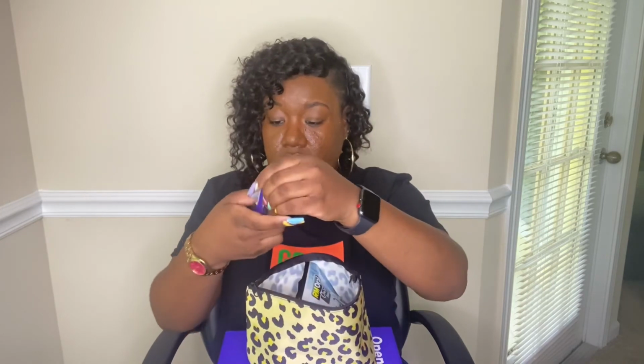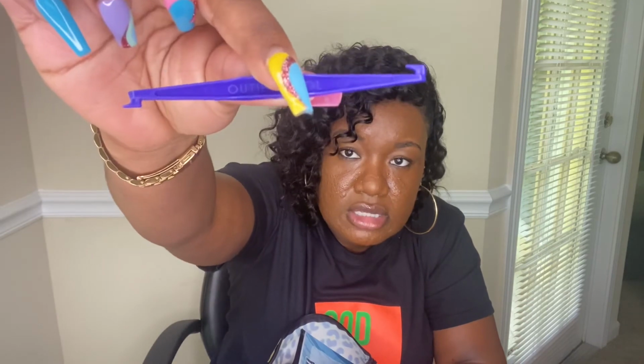Oh, and this is something else that came in the box as well. It is called an aligner remover thingamabob. It's really neat and very, very helpful. So one end looks like that and the other end looks like this. When you go to remove your aligners, you start from the back on both sides, and usually they'll pop up no problem, and that's how you take them out. So this little tool is really helpful. I use that every day, and I just make sure that it's in my little kit that I created, so I have everything when I'm on the go.